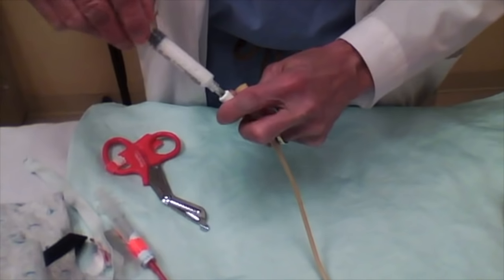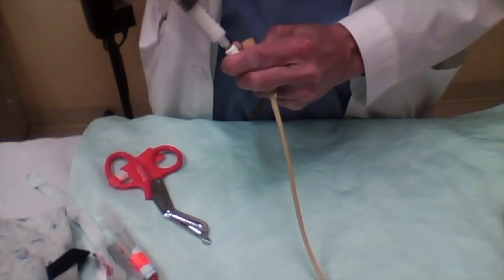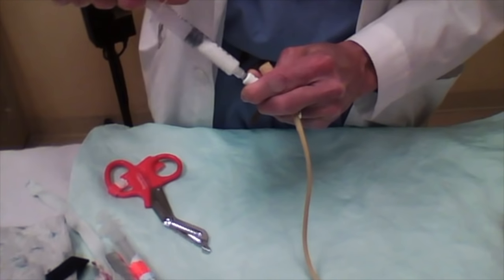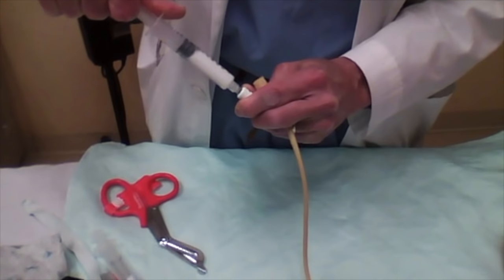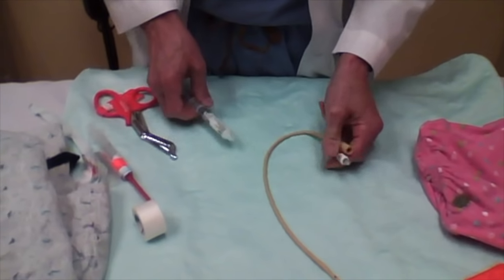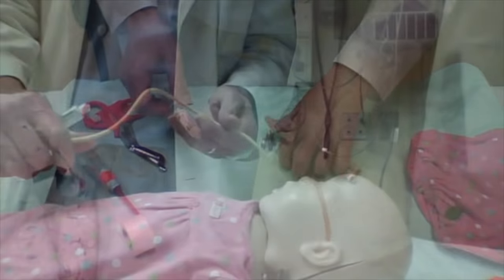When you're getting set to do this, one of the things you can do is fill the catheter with some barium and then pull it back out. This will leave a thin stream in there, so if there's any question of where the catheter is, you can take a quick x-ray and the Foley catheter will show up because of the lining of barium in it.